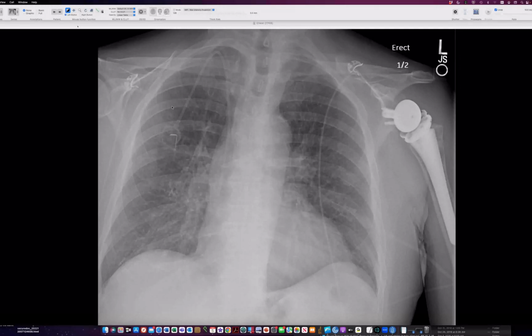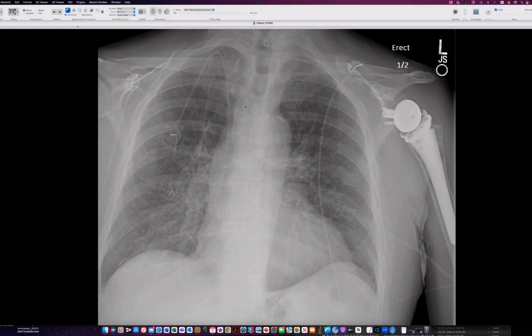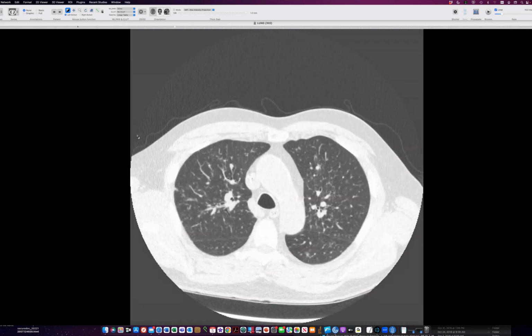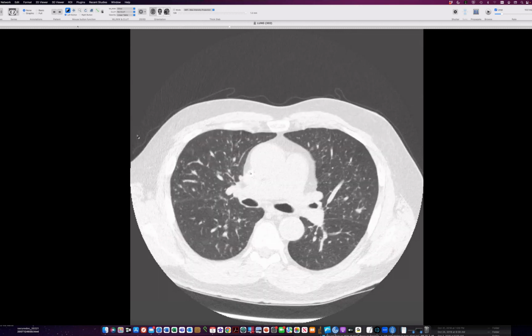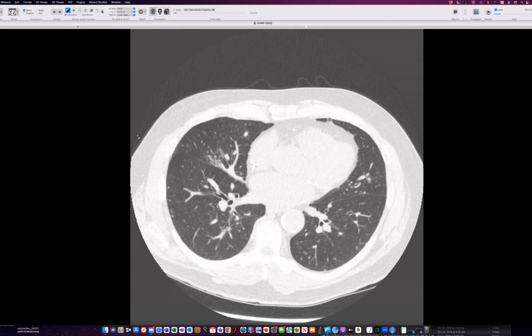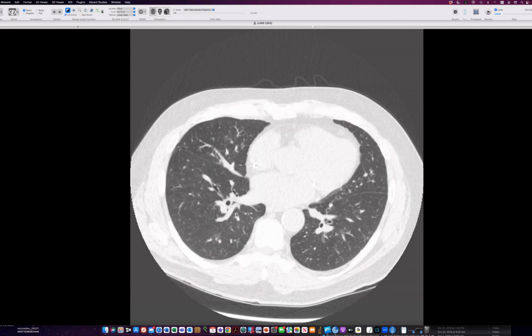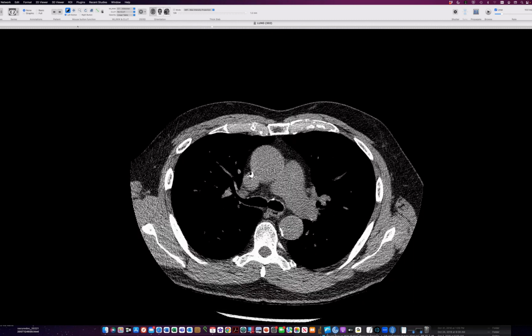Yes. Okay, right. Chest radiograph on this person who has been receiving chemotherapy for colon cancer, and he has this radiograph which looks kind of busy, but it's an ICU radiograph, and so you don't know how much of this could be something acute like edema. But if you look at his lungs, he's got a ton of upper lung nodules, small nodules, and a very nice sarcoid distribution, peribronchovascular, and along the fissures, lots of nodules along fissures here. And in terms of lymphadenopathy, not much, but this was biopsied and this was sarcoid.